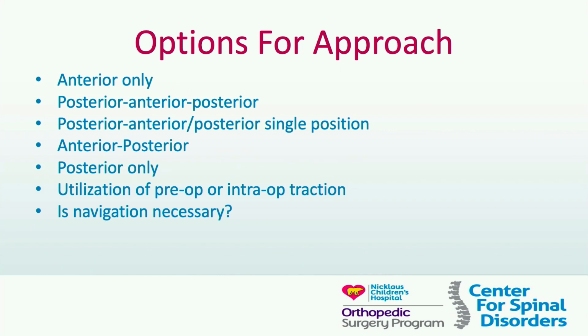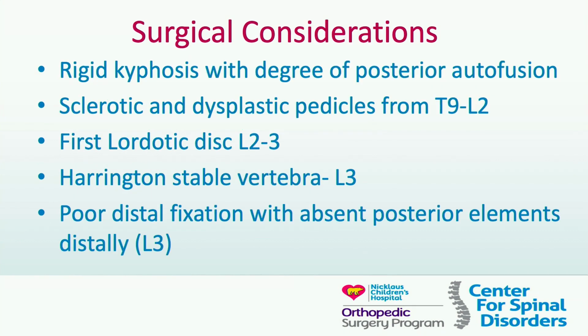So obviously there are several approaches for treatment of this, and the question is, is there a space for navigation here? Is it necessary? How will it change the way we can treat this patient specifically? So some of the considerations: we do have a rigid kyphosis, we've got really sclerotic and dysplastic pedicles in a real critical area of the deformity, and you have very poor distal fixation with absent posterior elements all the way down to L3.